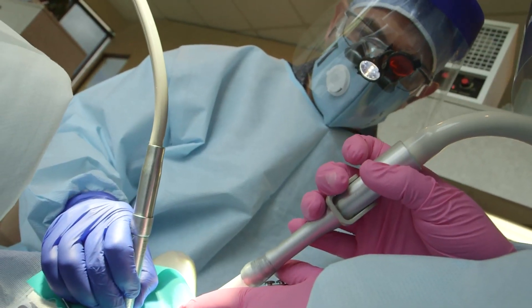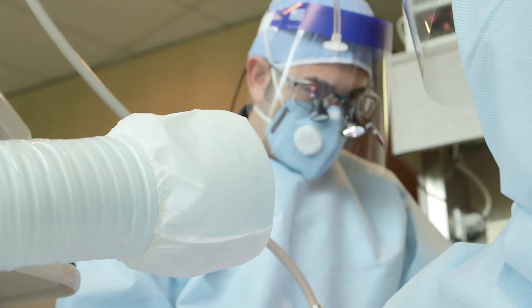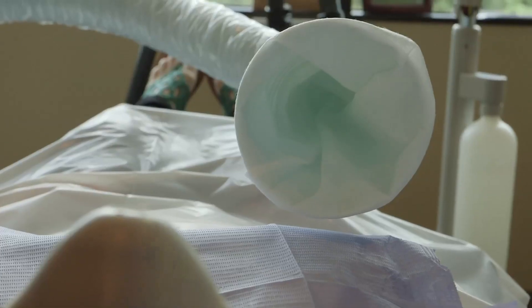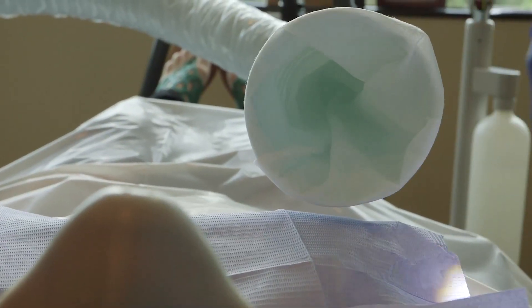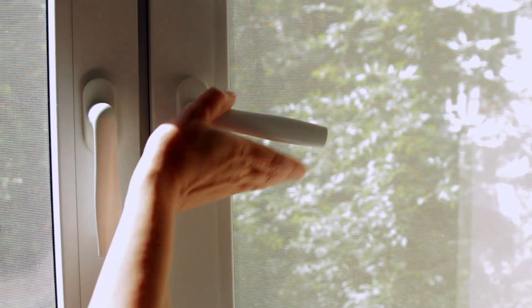Each room where mercury fillings are removed should have adequate filtration in place, which requires a high-volume air filtration system capable of removing mercury vapor and amalgam particles generated during the removal of one or more mercury fillings. If possible, windows should be open to reduce the mercury concentration in the air.